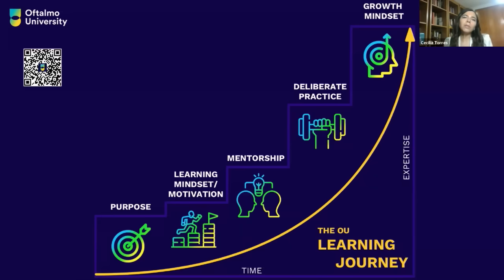Then you have to learn some skills, which are not only each step. My mentor used to tell me, you don't have to see it, you have to feel it. And it's not a Zen mode, it's rather a kinesthetic approach. You have to feel where you are. You have to feel the rhexis. You are doing it right because you feel the tension in your hand. And that's something you have to practice outside the operating room first.